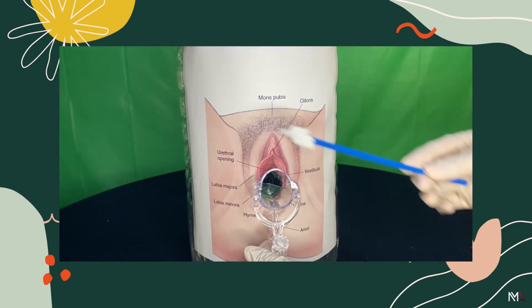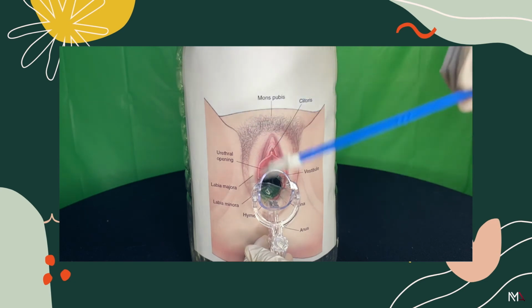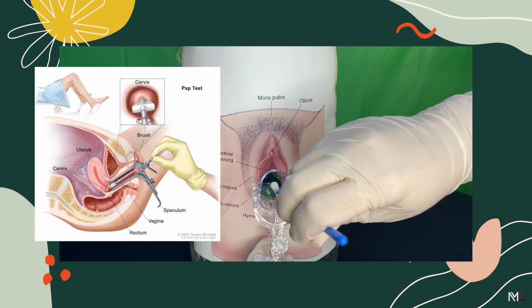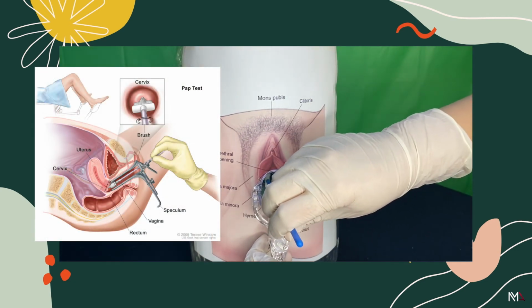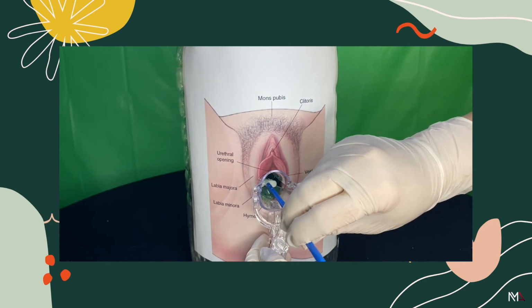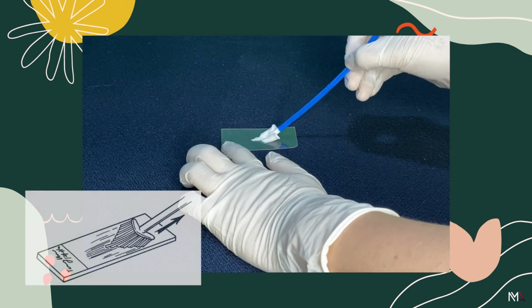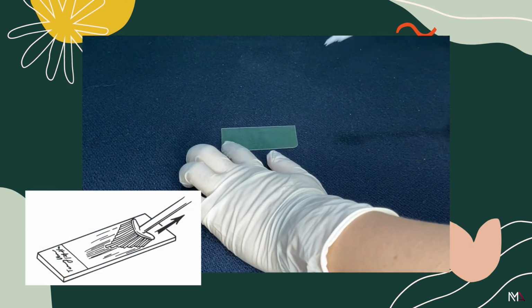A single broom-like sampling device is used to collect both populations of cells from the endocervix and the ectocervix. The sampling device should be rotated 360 degrees 5 times. The collected material is then spread onto the slide. The slide is then labeled and sent to the pathology laboratory.